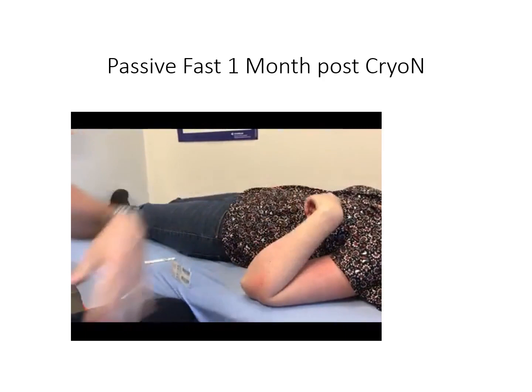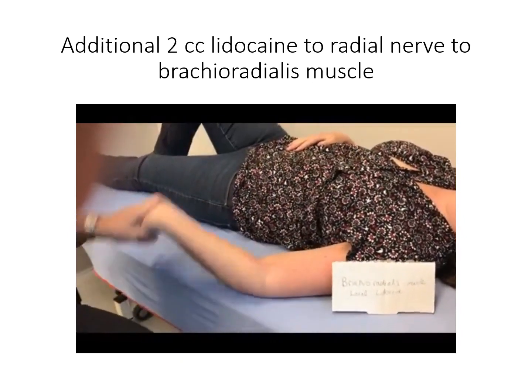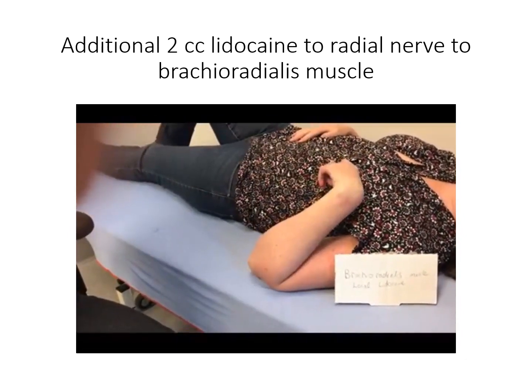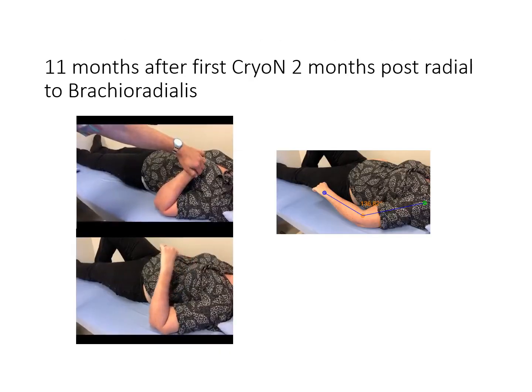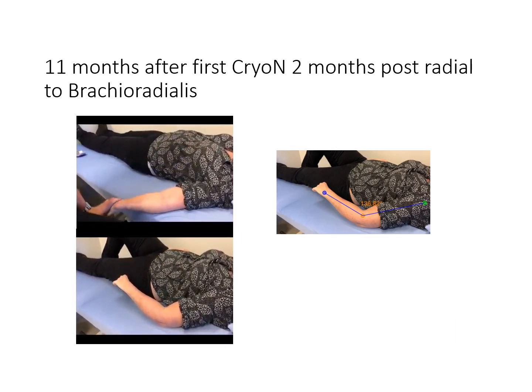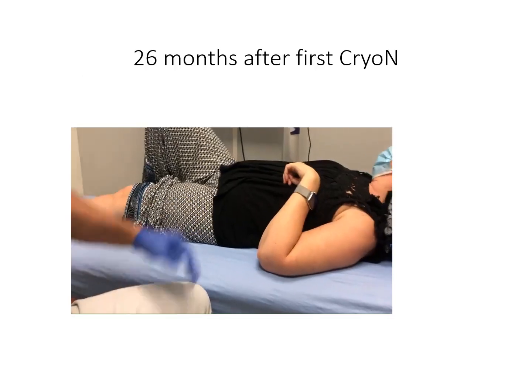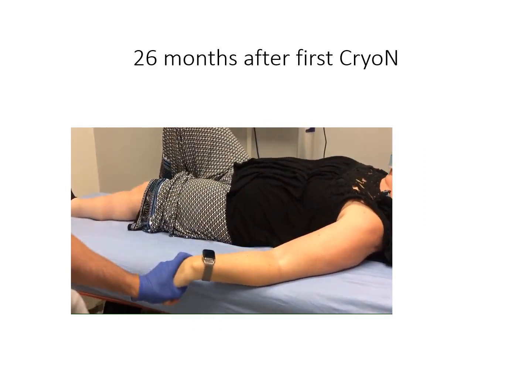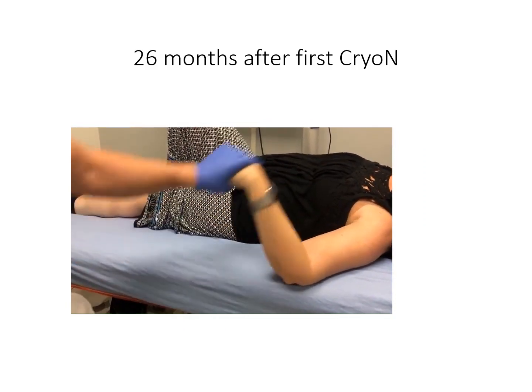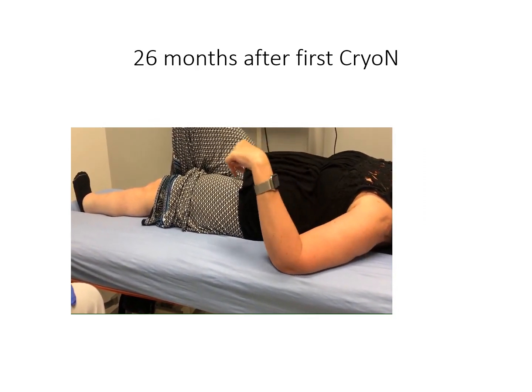There is still a notable catch in the muscle, presumed to be from the brachioradialis based on her presentation. As part of our clinical decision-making, the brachioradialis was blocked with a 2cc lidocaine nerve block. The patient then underwent a second cryoneurotomy, this time to the radial nerve branch to the brachioradialis, and the resulting change in range of motion — both active and passive — is seen here. This patient also had diversion of botulinum toxin injections away from the brachialis and brachioradialis. Having had no botulinum toxin injection in more than five months, this is 26 months after the first cryoneurotomy.